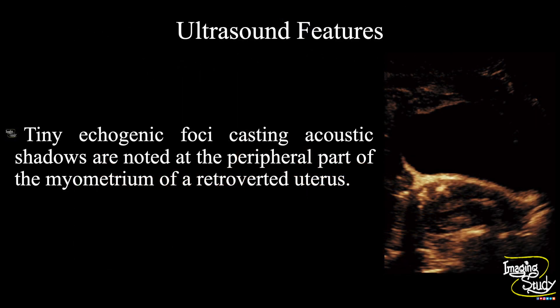In summary, tiny hyperechoic foci, some casting acoustic shadows, are noted at the peripheral part of the uterine myometrium of a retroverted uterus, as well as within the endometrium, indicating postmenopausal degenerative uterine calcifications.